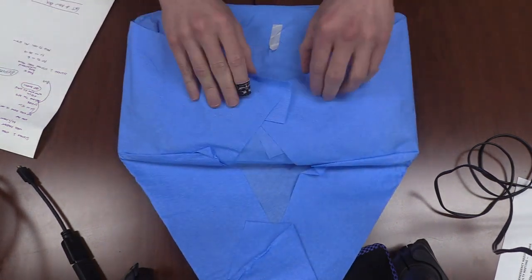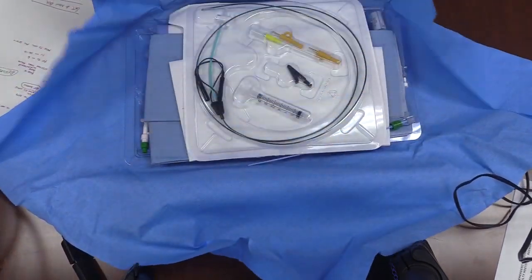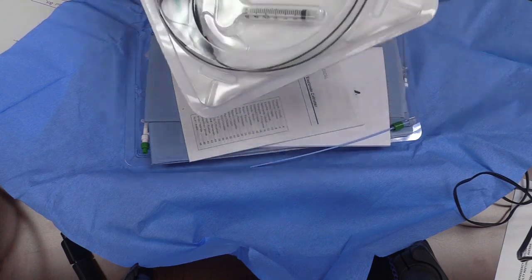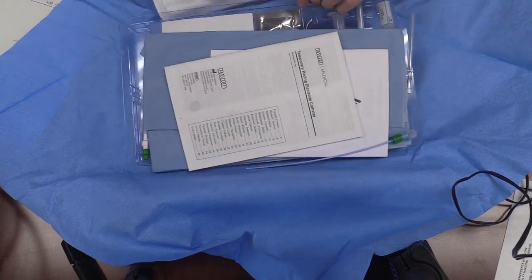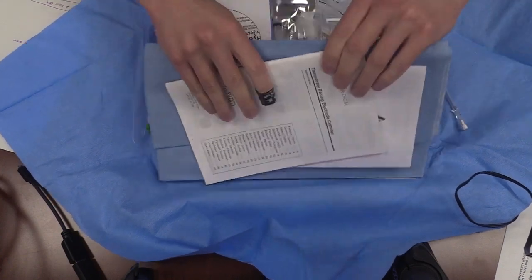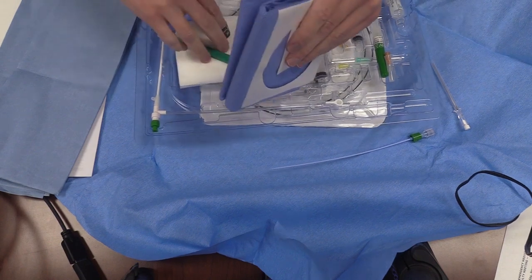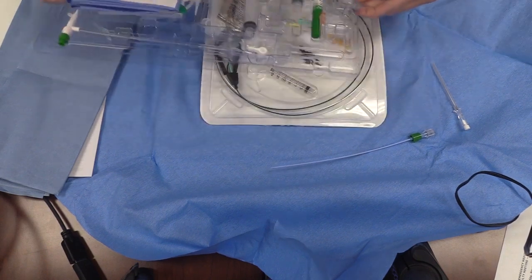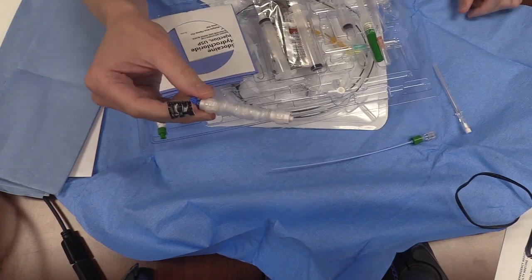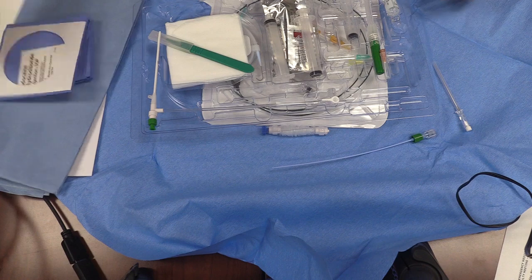You need the ultrasound, and you should grab one of those sterile central line bundles as well — that combination will have everything you possibly need. When you first open this up, there are basically two sections: the section with the pacemaker equipment and the section for the cordis placement. The one thing you really need for the pacemaker section — the sheath — should have been in the pacemaker kit. Take that and put it aside; you're not going to use it until you're actually placing the line.